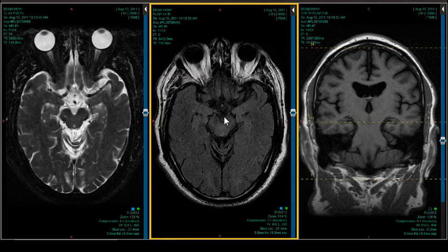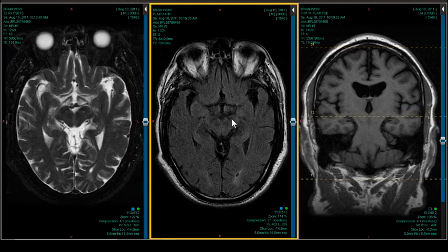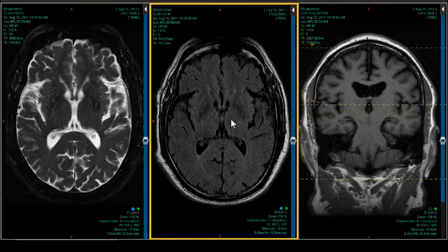And probably Wilson's disease would have been one to consider without knowing anything else, although the imaging isn't consistent with that. Now, also in Wilson's disease, you can get excessive iron deposition, excessive copper deposition, and you can get manganese toxicity or excessive manganese deposition. And each of them has different paramagnetic properties. So you're going to see some pretty weird high and low signals in the basal ganglia and thalamus.